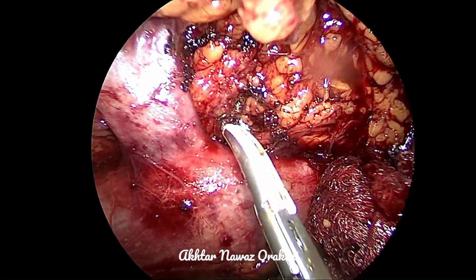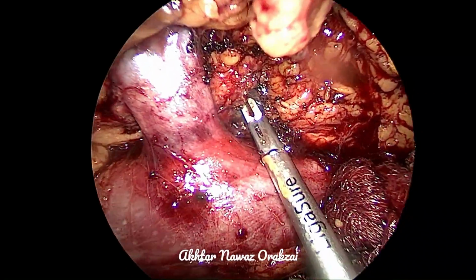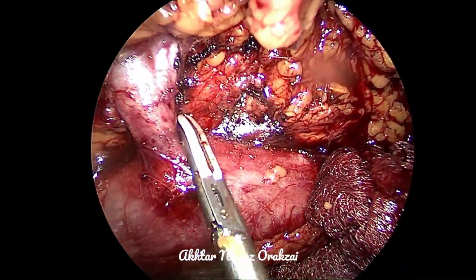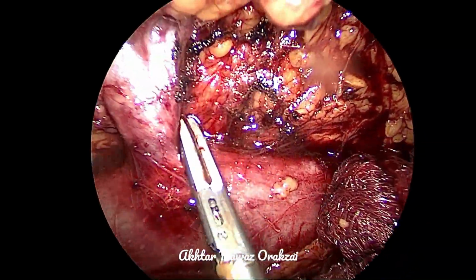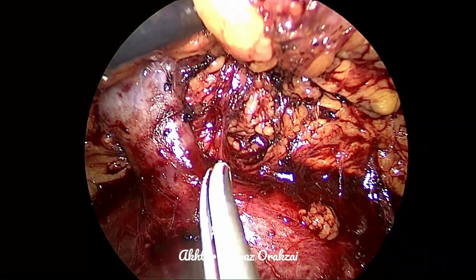As it is directly connected here on this side to the inferior vena cava, the pressure in this vein and the volume of blood will be more, so that can lead to torrential bleeding.